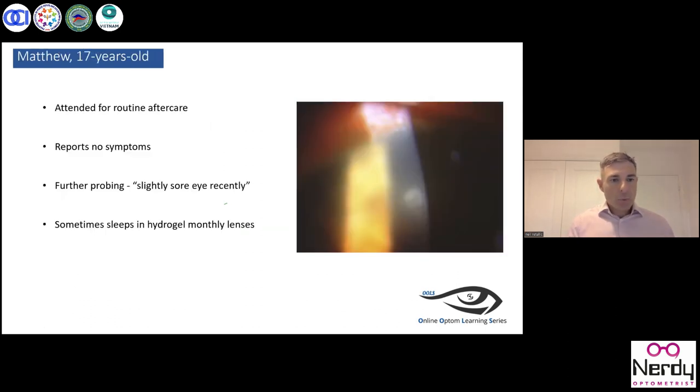Okay, so we'll move on to case number three, just to keep going. So again, Matthew attends for a routine aftercare. He doesn't report any symptoms. He's got a slightly sore eye, and he sometimes admits to sleeping in his hydrogel lenses. And you see this on the eye here. So I'll open the poll up just to get your thoughts on what it might be.